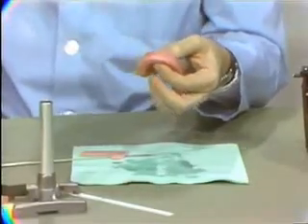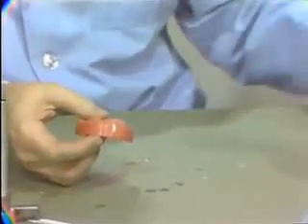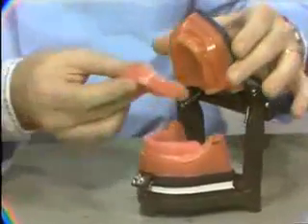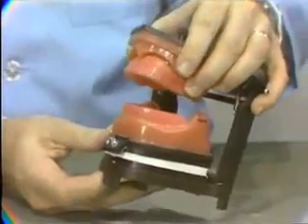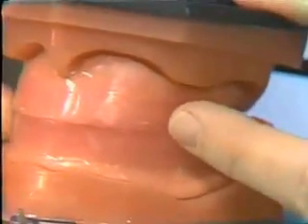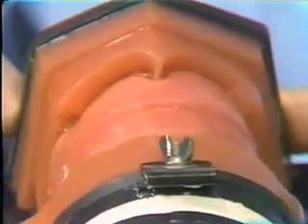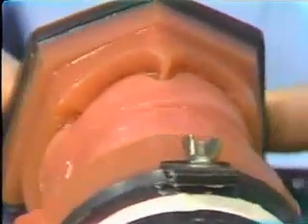Now, I have made ahead of time a wax rim, upper wax rim, that you should end up with. And once I place this back into the mouth or onto the mannequin and close the mouth, you can see that the wax touches evenly all the way around, and this is what you should end up with. Now, on the buccal surfaces, the wax will come about end to end. But in the anterior portion, you'll notice that there is a slight horizontal overlapping of the maxillary occlusal rim. And this is normal. This is what our teeth will look like when we finish also.